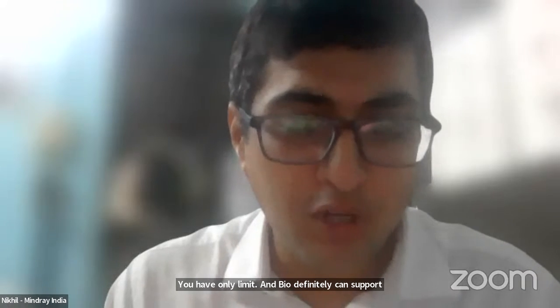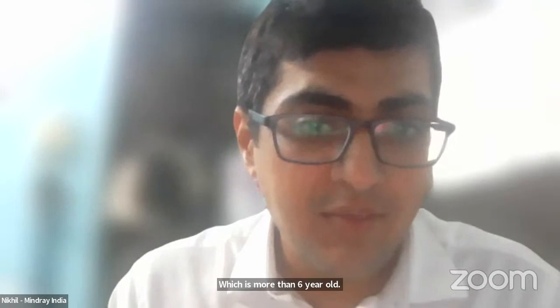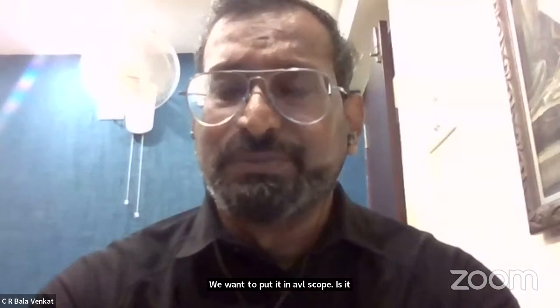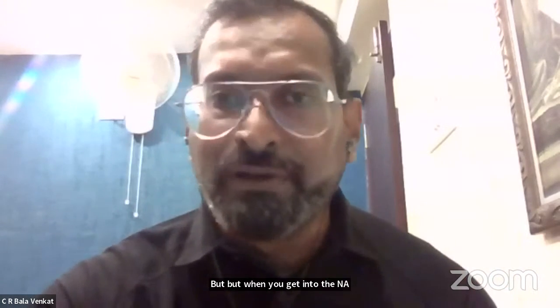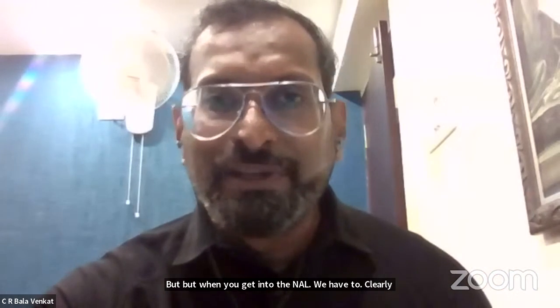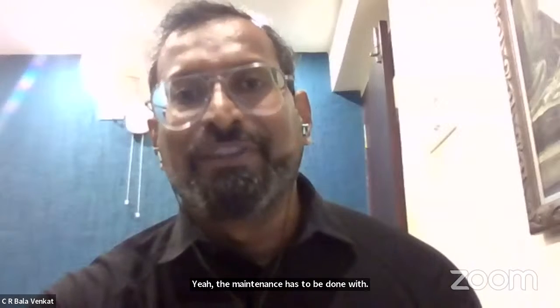Bala, one more product related question. We have a Mindray biochemistry analyzer which is more than 6 years old. We want to put it in NABL scope. Is it possible? Obviously it is possible. But when you get into NABL, we clearly have to have the machine under contract. The maintenance has to be done well, because it is a precision instrument and you need to see the calibration.